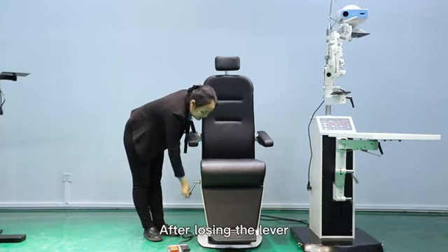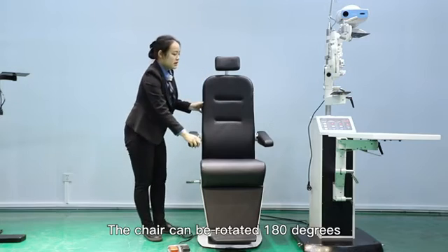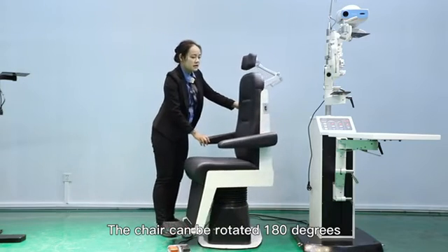After loosening the lever, the chair can be rotated 180 degrees.